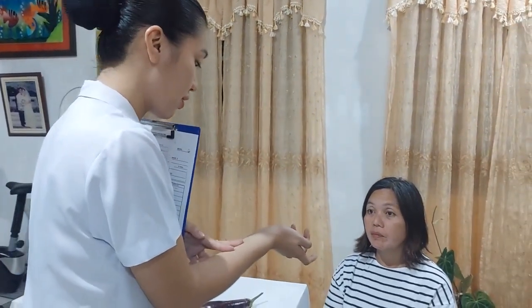Nadette, I am here because I'm going to do a skin test on you. We're doing this so we can know if you are allergic to this drug, because we're going to administer the medication later today. In doing the skin test, I will be injecting a needle in this area of your forearm, on the surface of your skin. You will feel a small prick when I insert the needle, and we will create a blister. Would that be okay with you? Yes, it's okay with me.